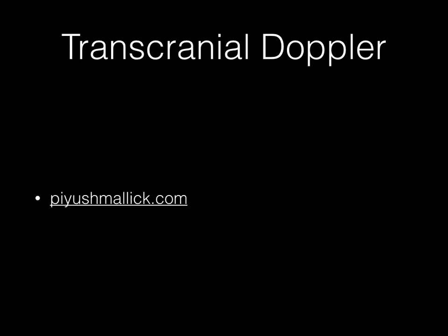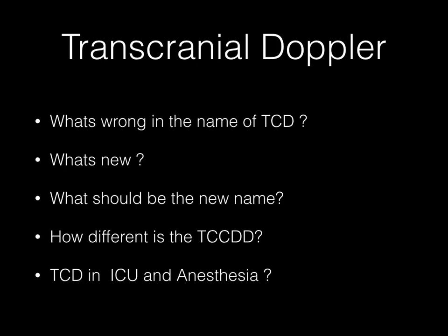Now, transcranial Doppler was popular in the 80s, right? And suddenly it disappeared. Nobody spoke about it. And why was that? You know, there is something wrong in the name even. Then what's new?